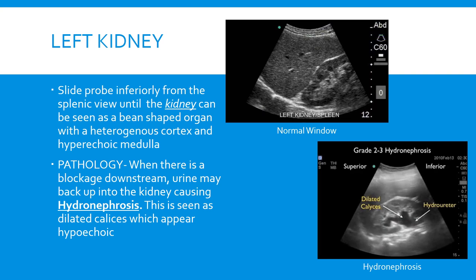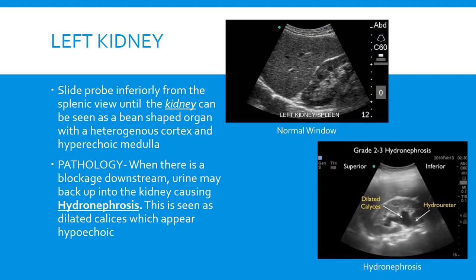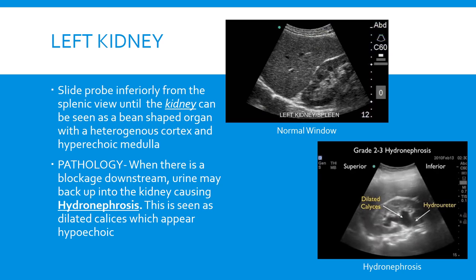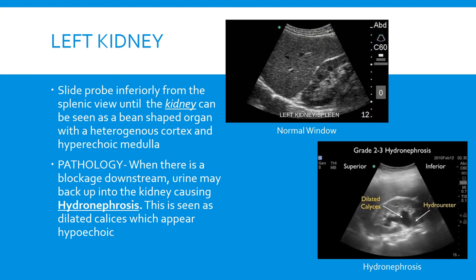Just like when finding the right kidney, to find the left kidney we slide the probe a little bit inferiorly until the kidney comes to the center of the screen. Once again we're looking for hydronephrosis, which is seen as dilated calyces showing up as a hypoechoic signal in the medulla of the kidney.